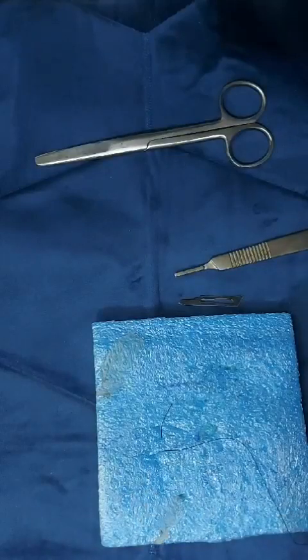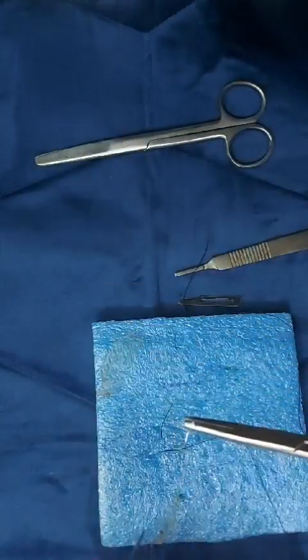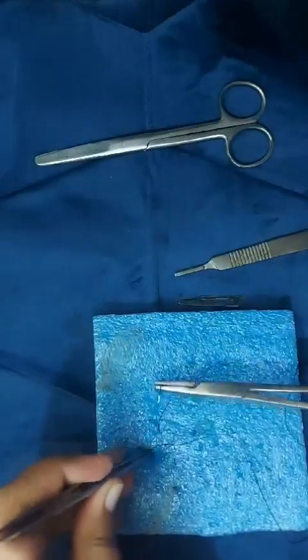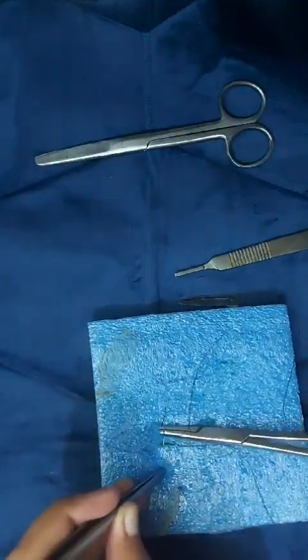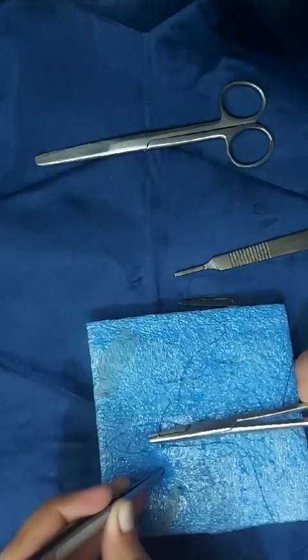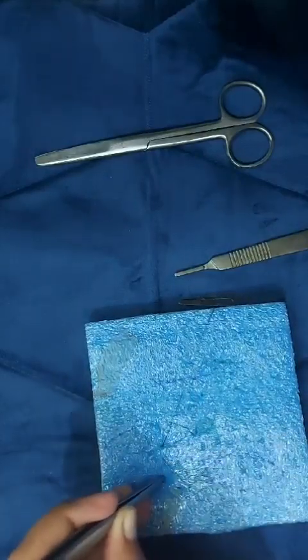Then again release the needle from the needle holder to reach the other end, and then insert the needle on the opposite edge of the wound at an equivalent depth, not more than 1 to 2, 3 mm apart, and then approximate it.